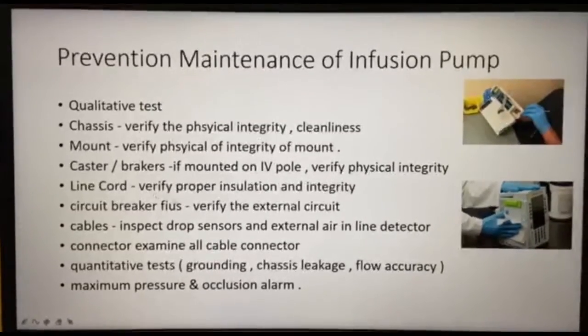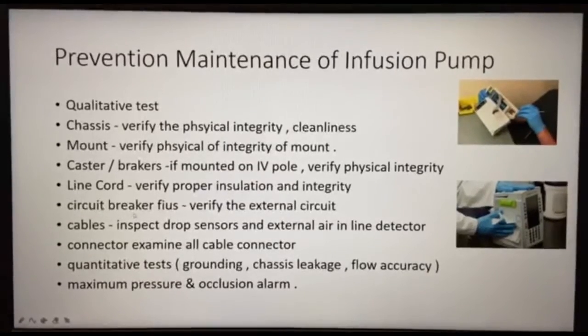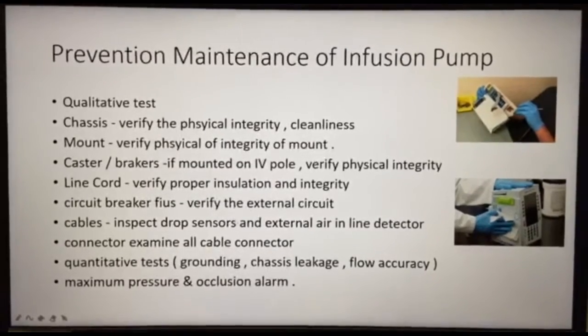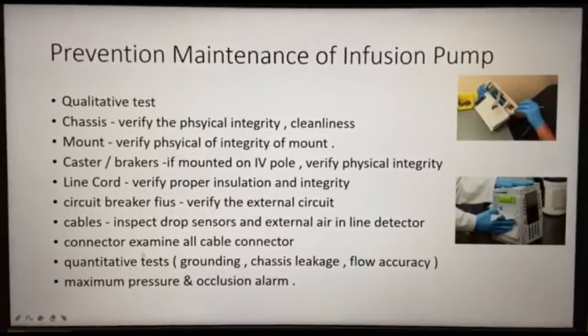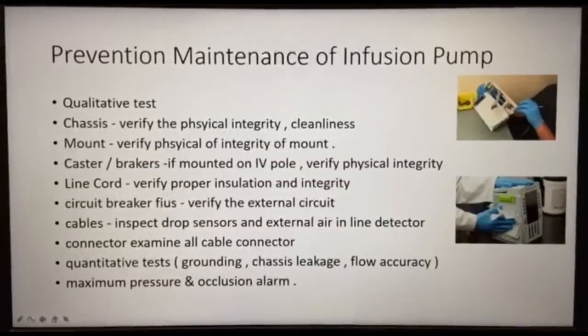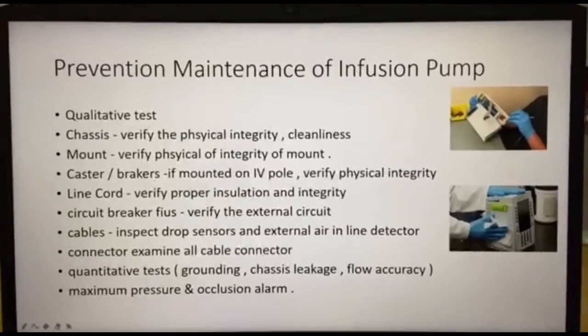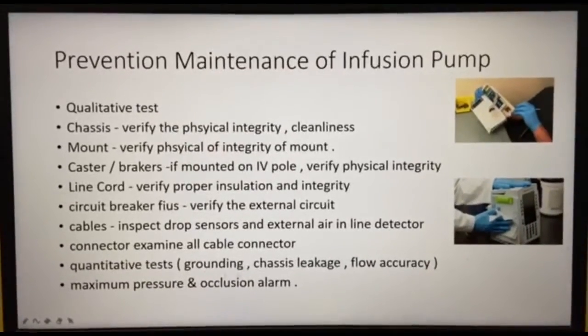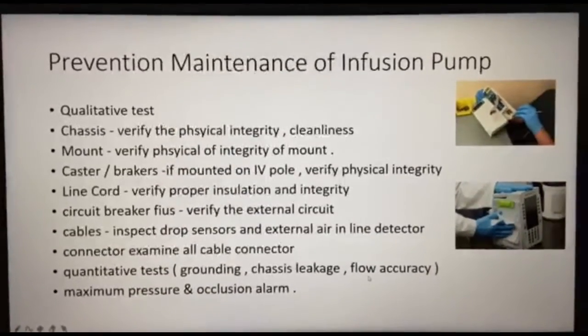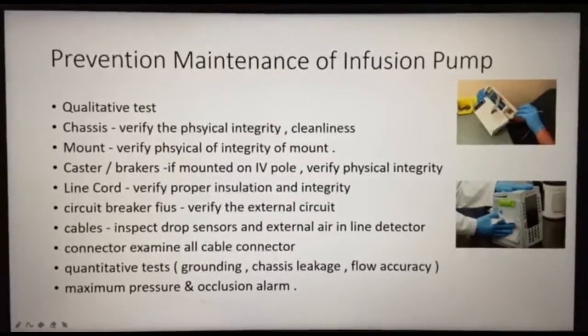Line cord: verify proper insulation and integrity. Circuit breaker fuse: verify the external circuit. Cable: inspect the drop sensor and external air-in-line detector. Connector: examine all cable connectors. Quantitative tests are grounding, chassis leakage, flow accuracy, and last, maximum pressure and occlusion alarm.